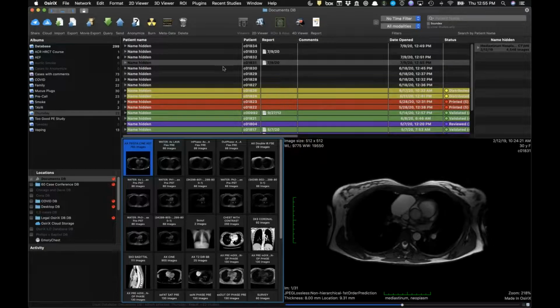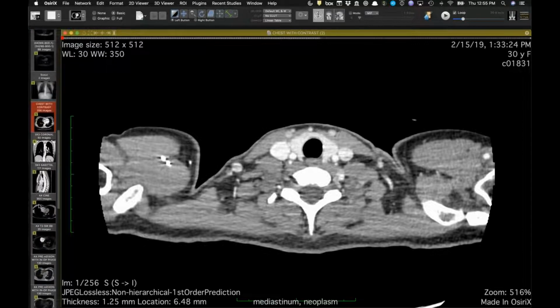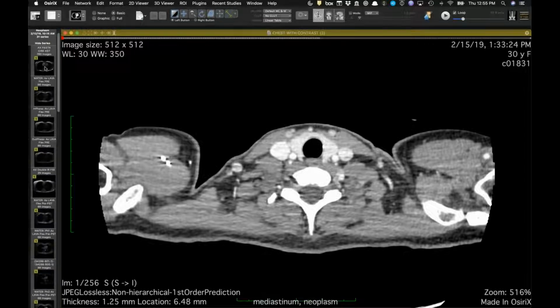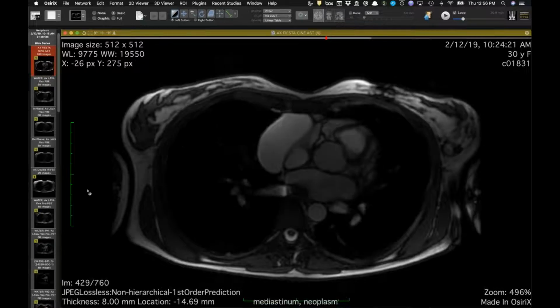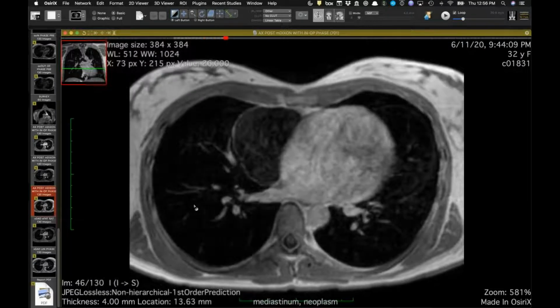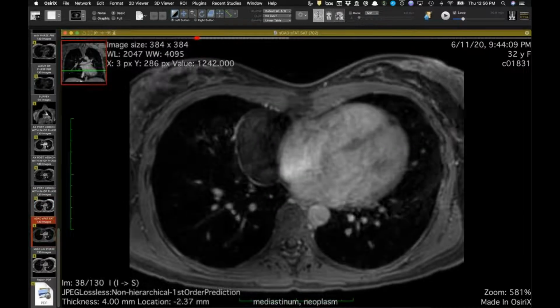Travis, does that mass effect on the right atrium also? I think a little, but it wasn't really. Let me go back to the cines. I thought the interventricular septum was flattened. No, a cyst wouldn't do that. They shouldn't. No, but on the second one, it looked different. Yeah, the follow-up was done more as just a standard thoracic rather than cardiac protocol. No, there's no real mass effect there.